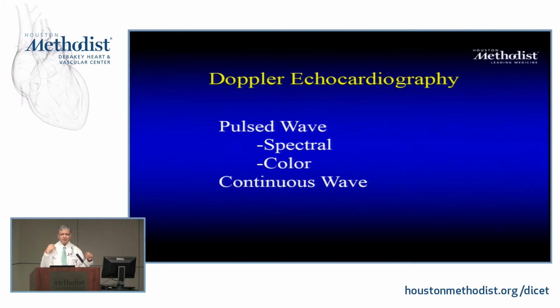How intense was it, so I can put it in the space and give it a certain brightness? And then I can follow, obviously, if the heart is moving, not moving, et cetera. Doppler is actually asking a different question from the same frequency that you sent. And that's how you build pulse Doppler, spectral, color, and continuous wave.